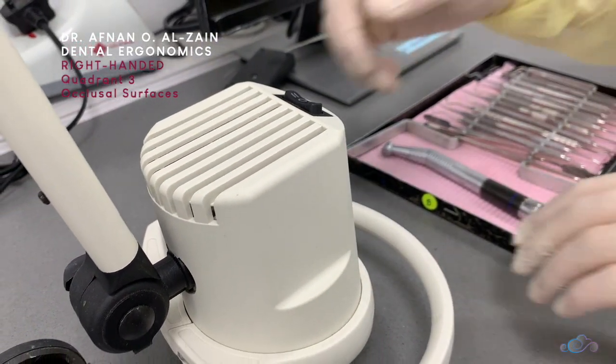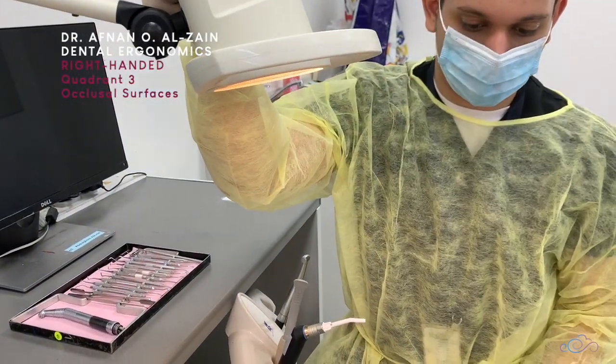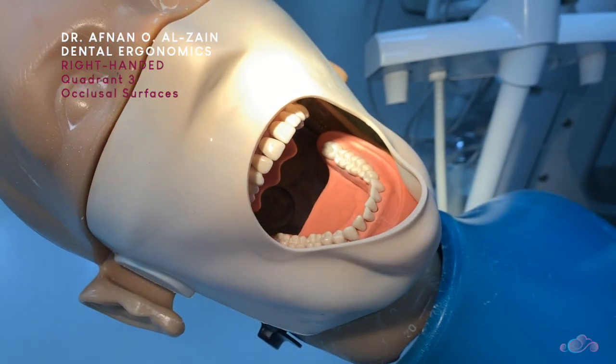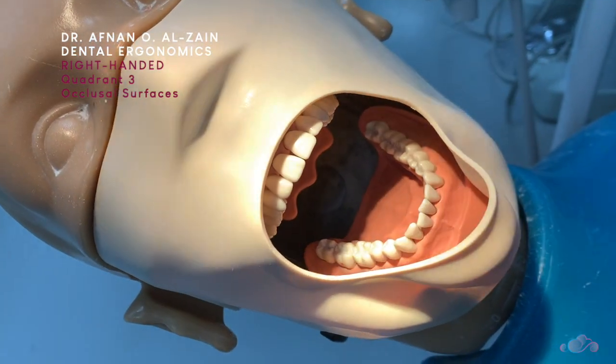Then we're going to adjust the light. We're going to start moving the light from the patient's chest, moving to the oral cavity. This is how we're going to position the light when working on quadrant three, and this is how we're going to position it when working on quadrant four.